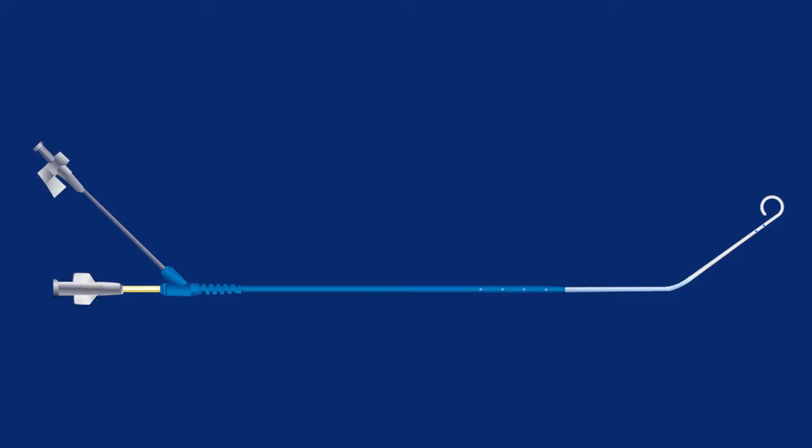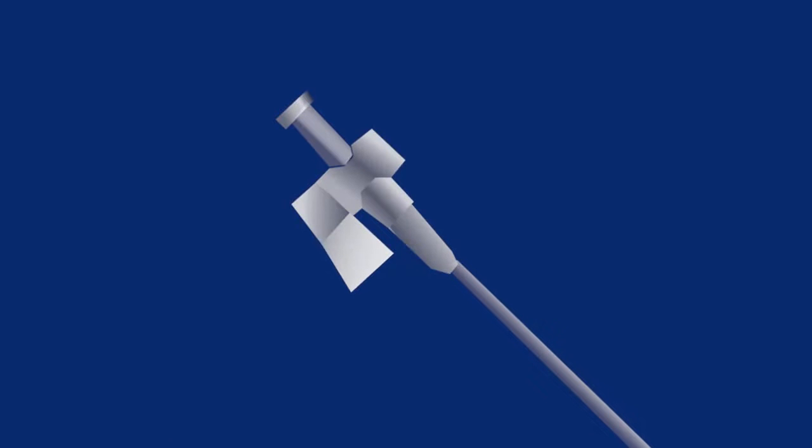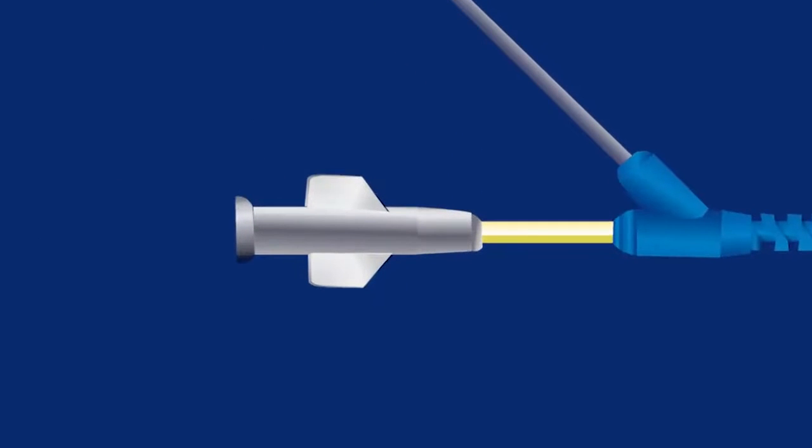The catheter's 2-in-1 coaxial lumen design allows for connections to separate pressure transducers. This provides simultaneous pressure measurement and calculation of the pressure gradient. The outer lumen is used to measure the aortic pressure, which connects to the medial side holes. The inner lumen is used to measure left ventricle pressures, which connects to the pigtail. The pigtail can be used for contrast injection.